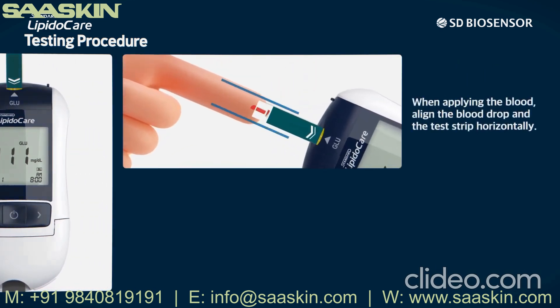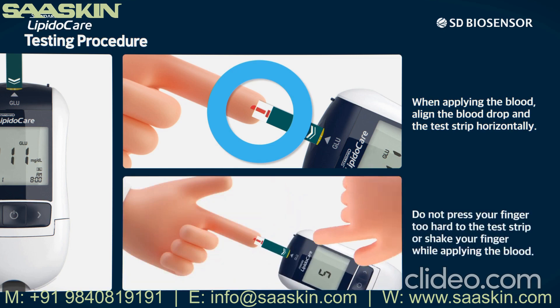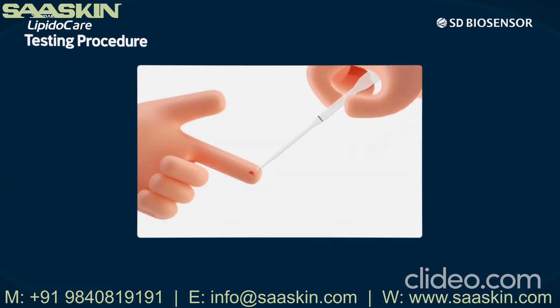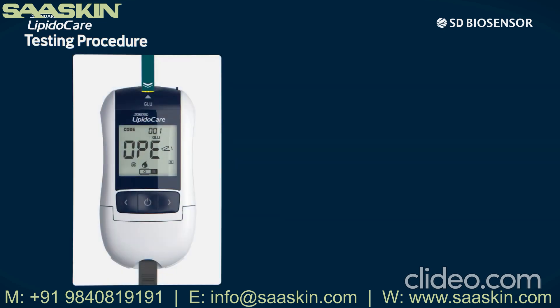When applying the blood, align the blood drop and the test strip horizontally. Do not press your finger too hard to the test strip or shake your finger while applying the blood. Collect the blood up to the marked black line of the Standard Easy Tube Plus — lightly hold the tube to the blood and it will be drawn upwards due to the capillary phenomenon.